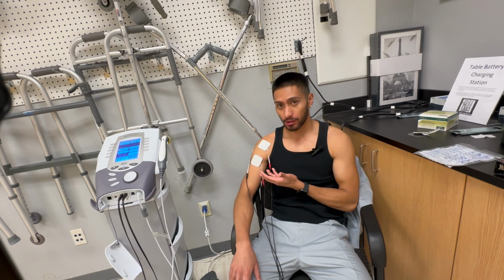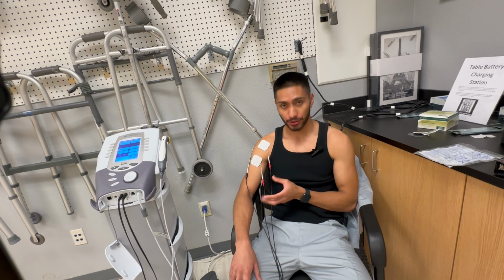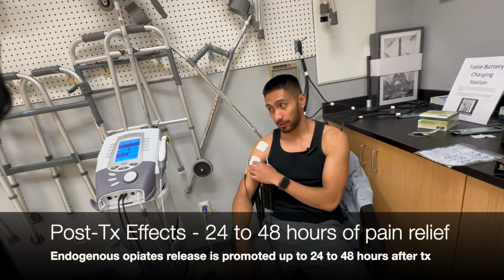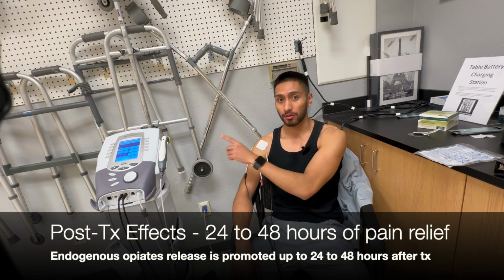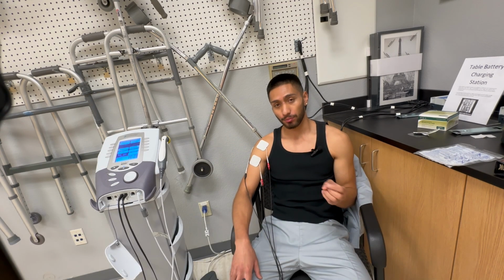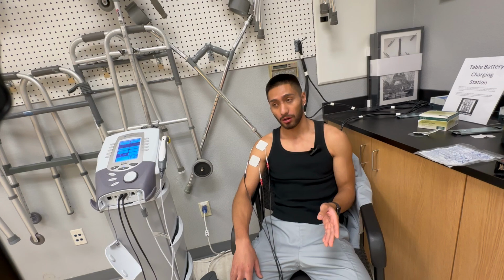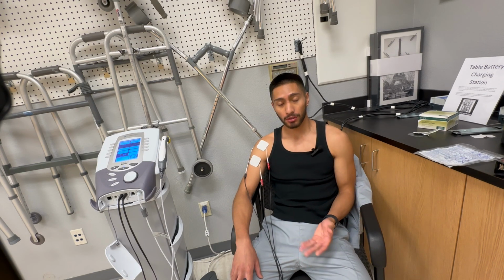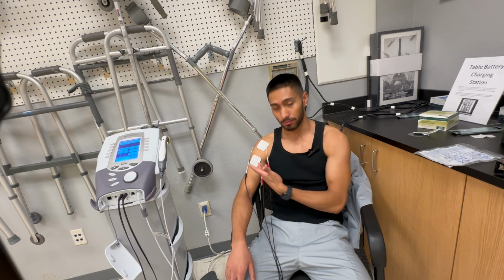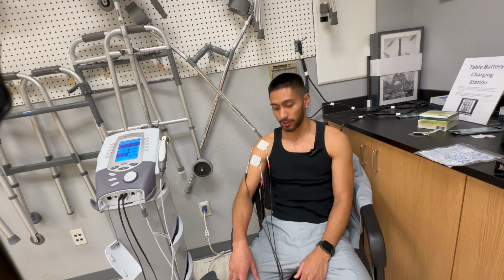Now with treatment time, this is 20 to 30 minutes, right around a 20-minute treatment time. However, post effects, especially for these specific parameters for endogenous opiate release, I should be able to feel effects of opiate release for up to 24 to 48 hours post-treatment, where I'll have pain reduction going on in my shoulder for that amount of time.